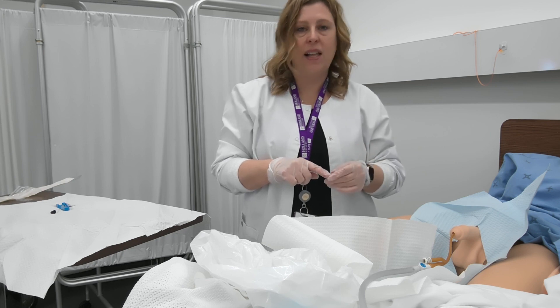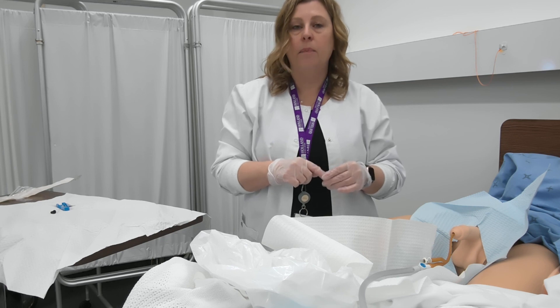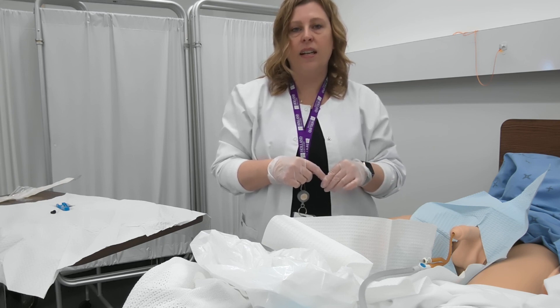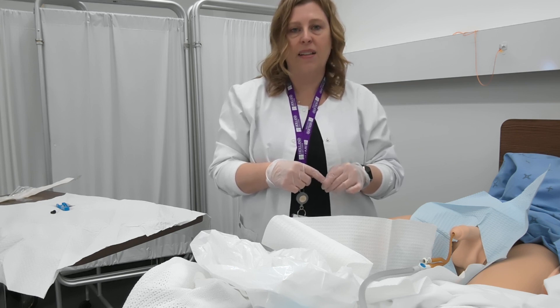I'm going to do some teaching with my client. I'm going to get them to drink a little bit more fluids, be careful when ambulating or moving from side to side in the bed so they don't tug on their catheter. And if they're able to, I will instruct them on how to do perineal care. And that's it for male catheterization.